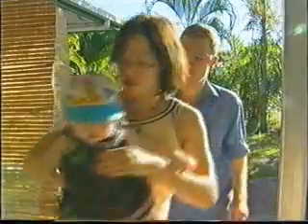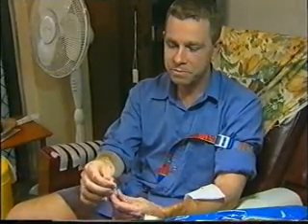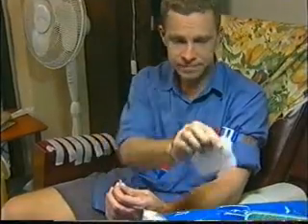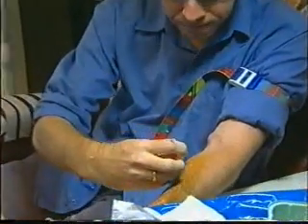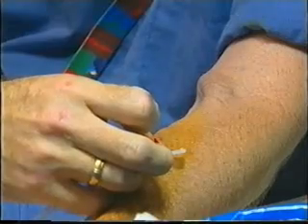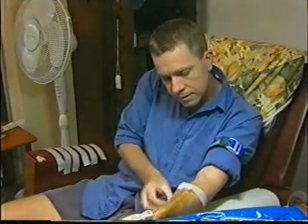When you put yourself on the machine, people choose a quiet, safe place to do it. Here is Mr. Harding again, showing us what he has to do. I'm going to put the needles in now. First time I did this, it was a bit scary, but the more you do it, the easier it gets. And now I won't let anyone else do it, because I do it better than anyone else. This is the first one I'm putting in. That's in, didn't hurt at all. Just put some tape on, just to keep it in place.